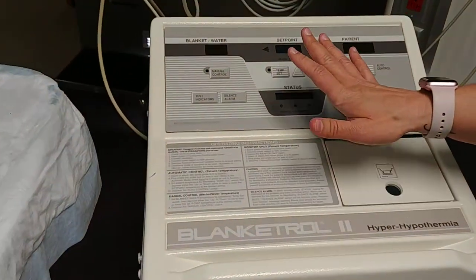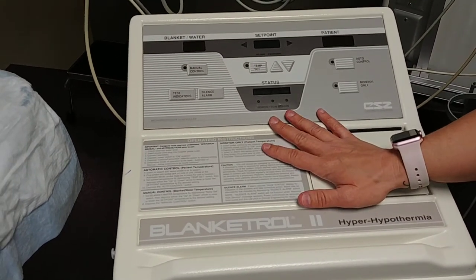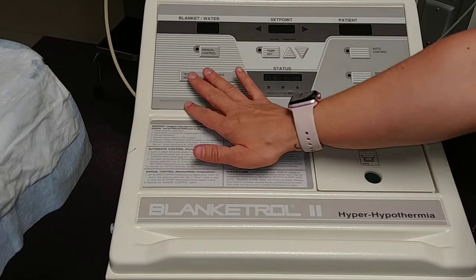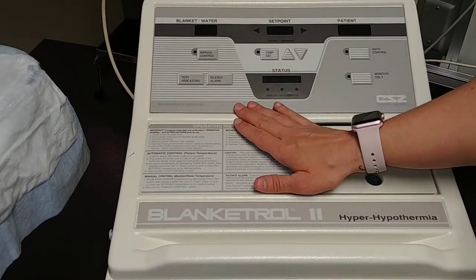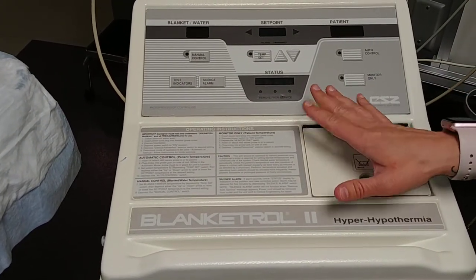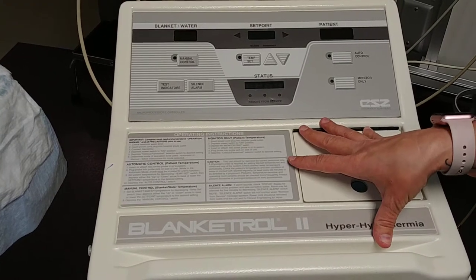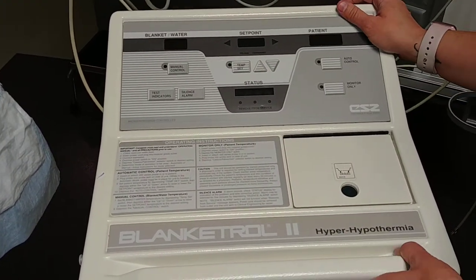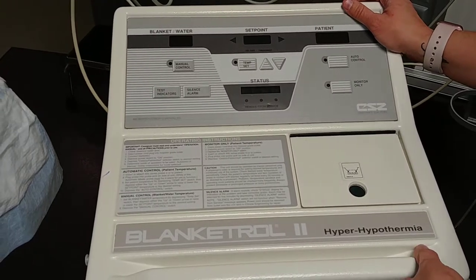You will also need the actual machine, the Blanket Troll. We have one dedicated machine for the PICU. It has a blue face and it says 'I belong to PICU' underneath it. That machine should never leave the unit. We clean it, wipe it down, and return it to one of the Omni-Cell storage areas.